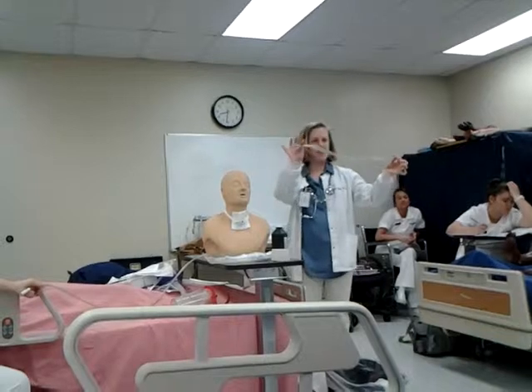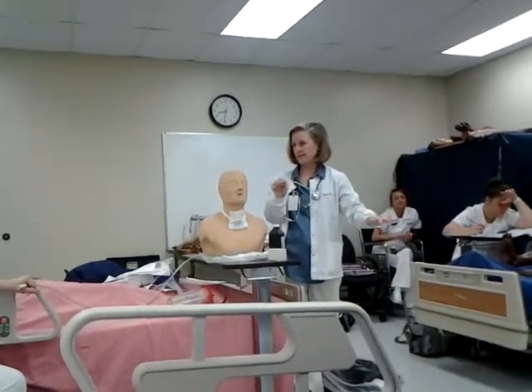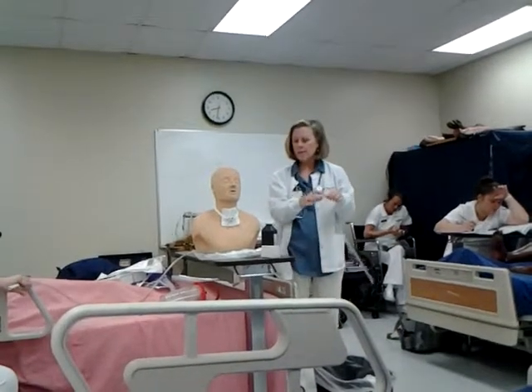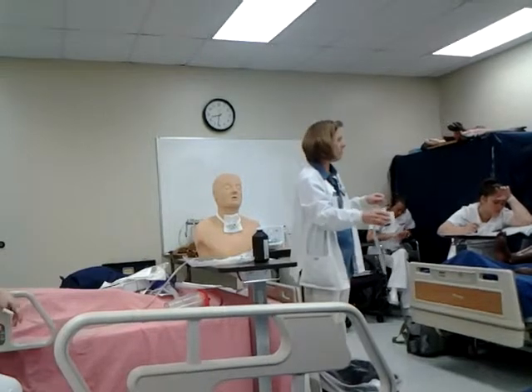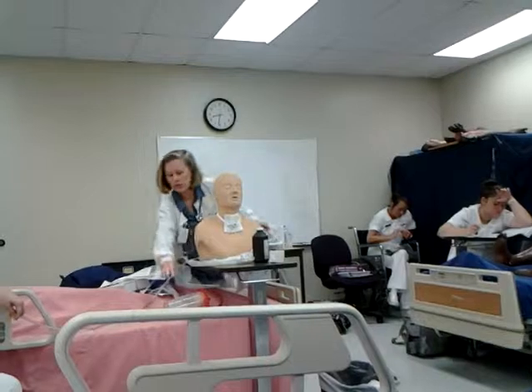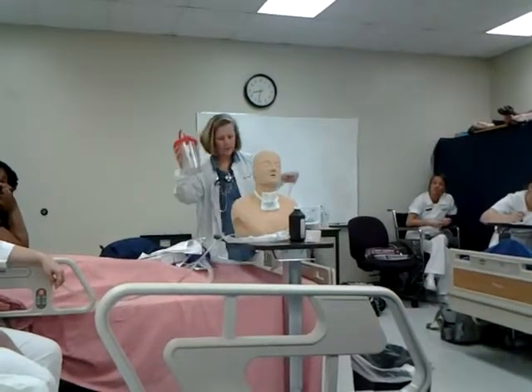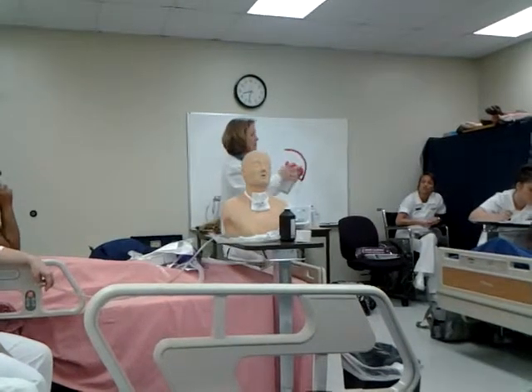So that's the difference in these two. Your kits do not have the plastic sleeve on them. Right? When we look at our saline right here, we're suctioning this into our canister. Do we have to account for that on our intake and output? Yes, we do.